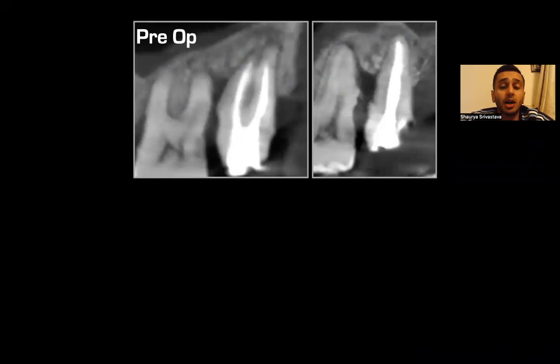He had a massive gag reflex. Wanted to get the upper 7 retreated, and with the rubber dam and using RVGs, the RVGs are very bulky. Getting X-rays was very, very difficult. So I could not get a decent pre-op radiograph. So I said, okay, let's just take a scan. Let's try something new this time, because normally I always take a pre-op radiograph first and then take a scan.